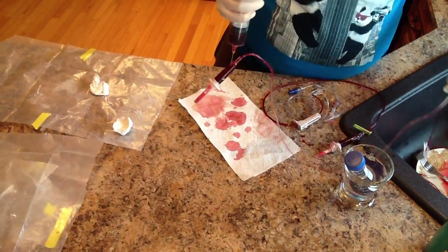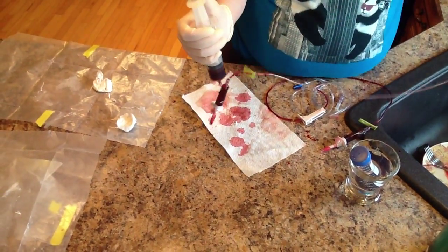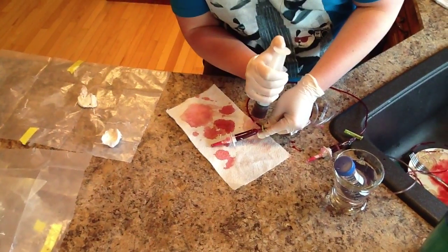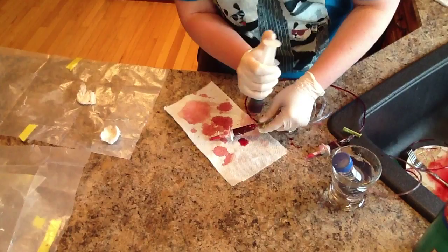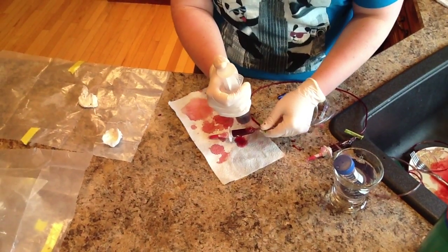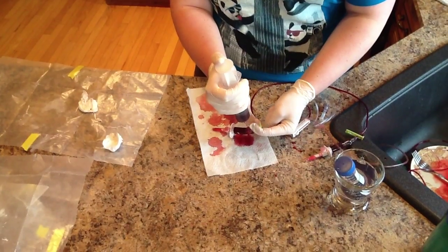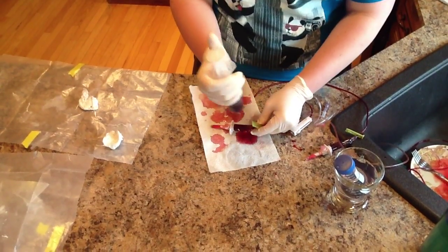Now that we've injected, we are going to take our clamp, and after the chamber is completely full, no oxygen. I clamped that a little too soon. I'm going to unclamp it. Okay, this is going to be messy.